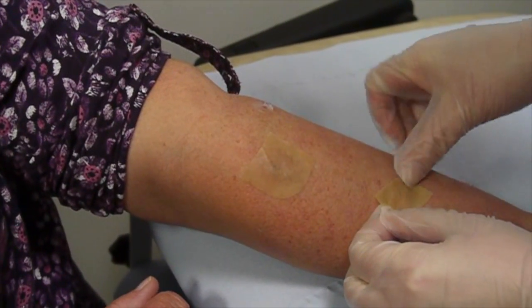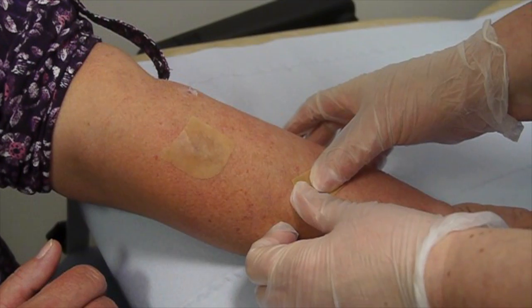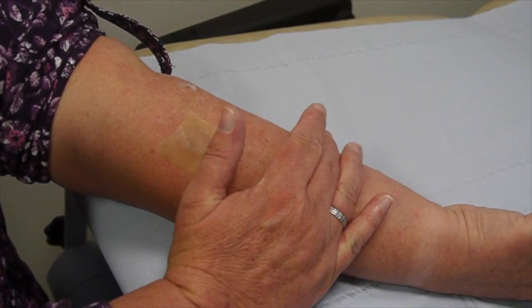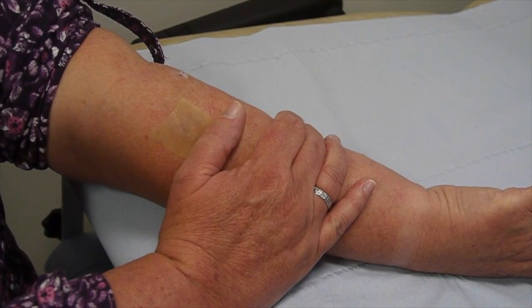These pieces of dressing can be left in place for two to three days — they're waterproof, so you can bathe and shower with them. The hydrocolloid dressing can then be taken off and hopefully the eczema will be much less itchy and flattened down. The whole process can be repeated for two or three occasions until the eczema settles.